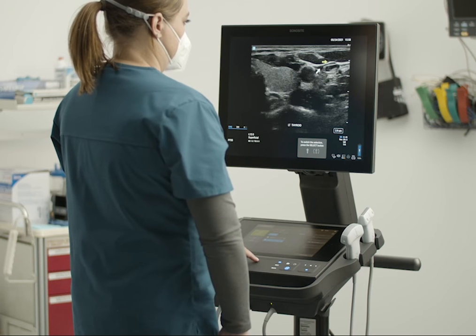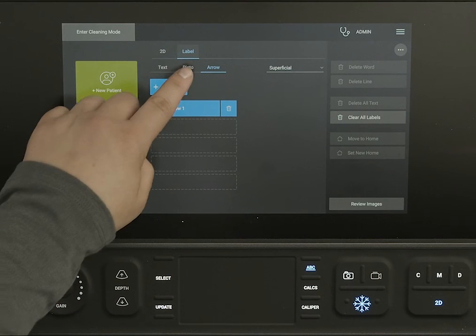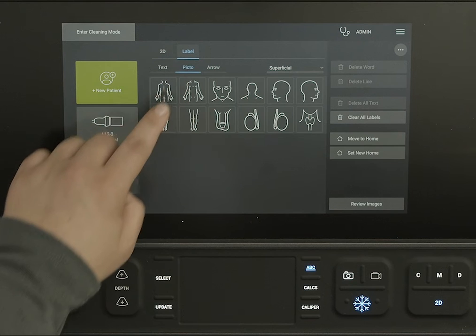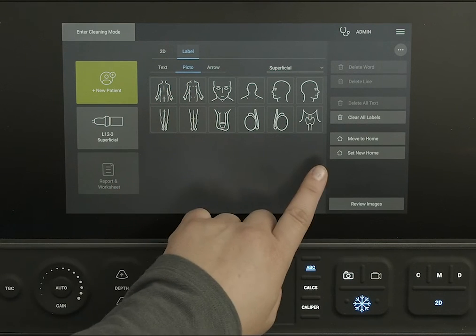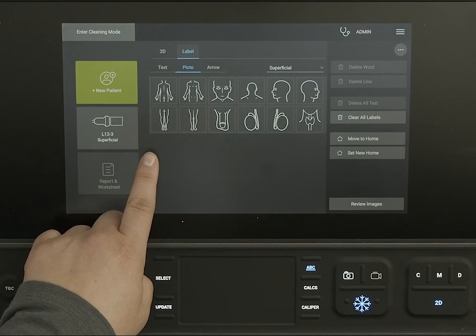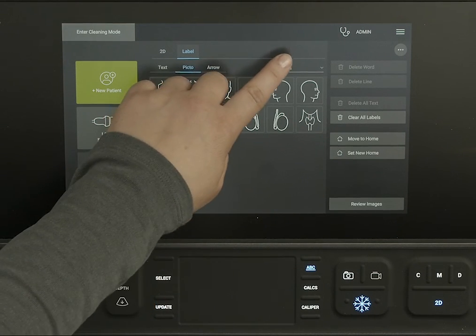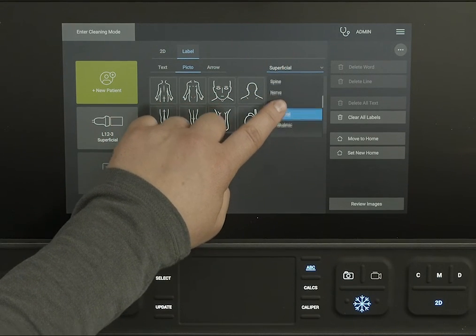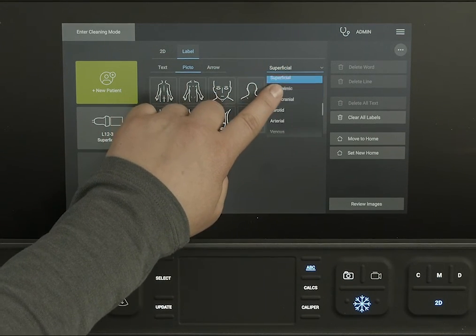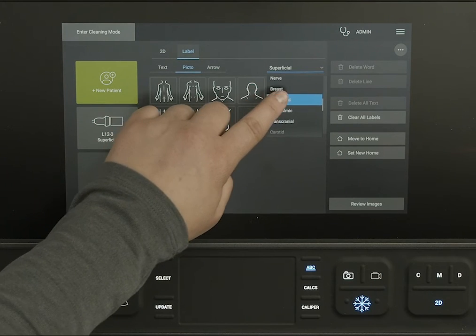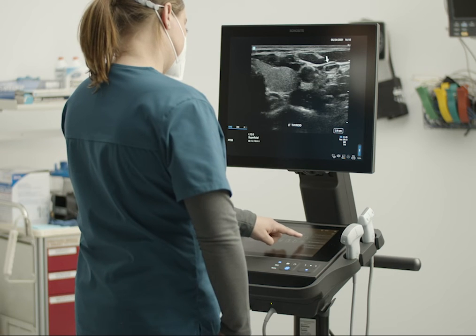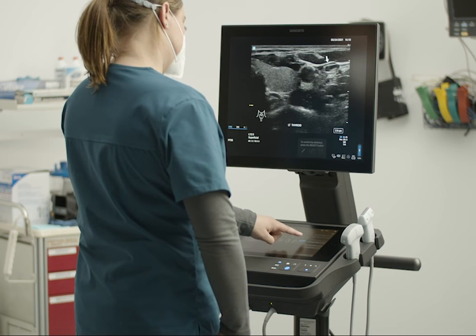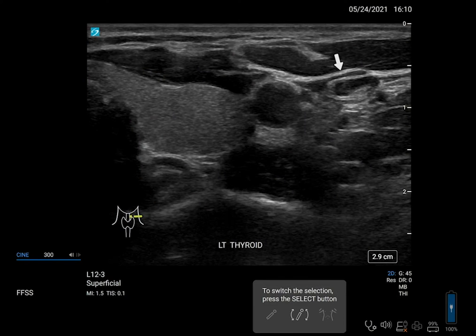You can easily add more arrows, select arrows, and delete arrows. To add a pictograph, tap Picto. The pictographs available on the screen depend on the exam type you are currently in, but you can always choose a pictograph from the menu. You can place the pictograph in various positions. Each pictograph comes with a transducer orientation marker. Rotate the marker to indicate the orientation of your image on the pictograph.